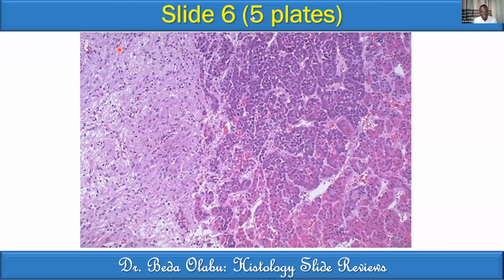Okay, I'll give it to Abdi Rashid. Yes, hello, sir. Hello, Abdi Rashid. Yes. From this magnification, I can see only two parts. One side looks fibrous, the left side, and then the other side looks deeply staining. Very good. So what do you think? I think it's somehow the slide of the pituitary gland. All right, very good. That one is straightforward.